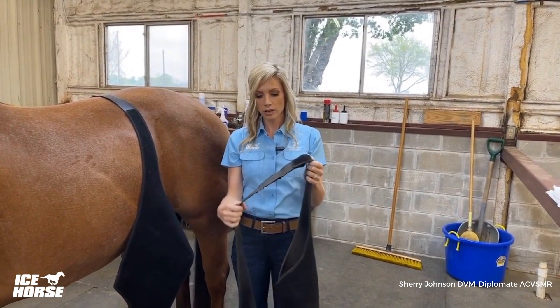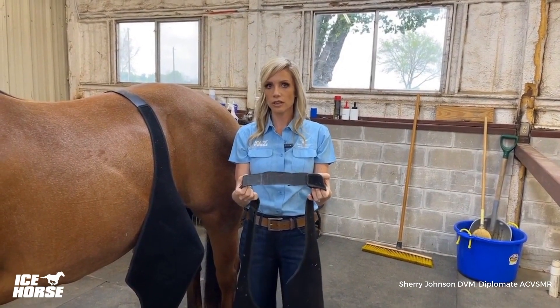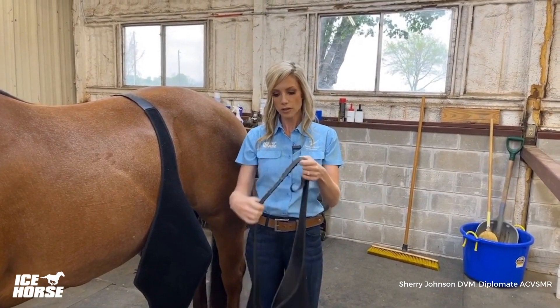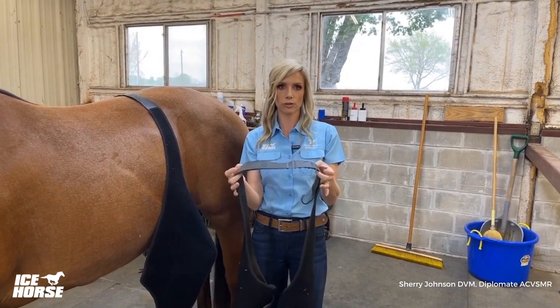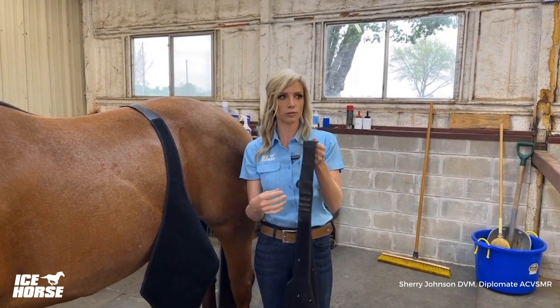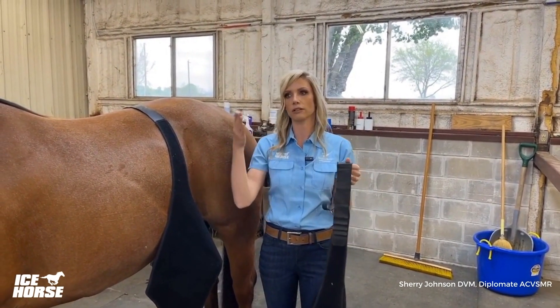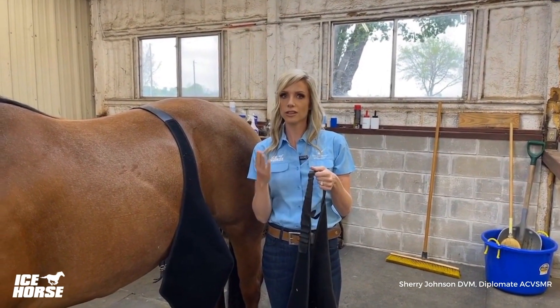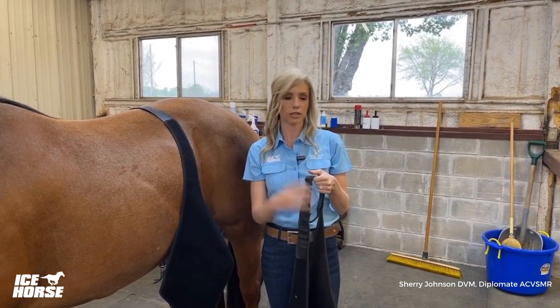Depending on the size of horse you're using them for and the variation in sizes, you can label which pair is fitted to which horse. So we'll have a pair labeled for this particular horse and a pair for that one, so we don't have to adjust the size — it's just ready to go every single day.